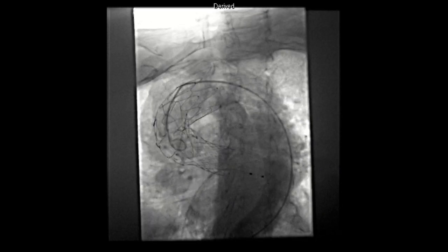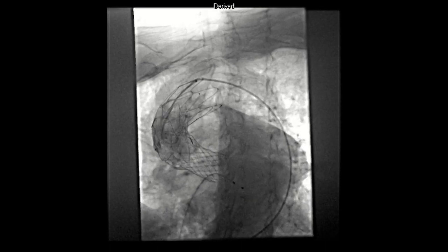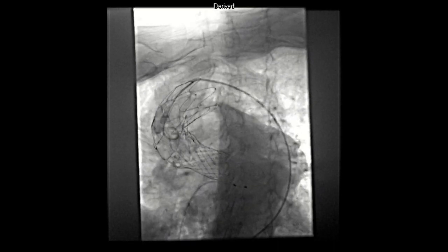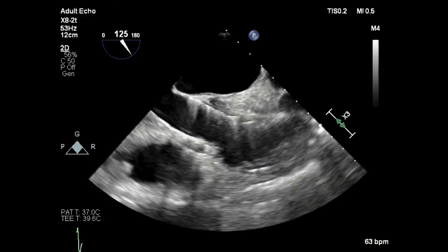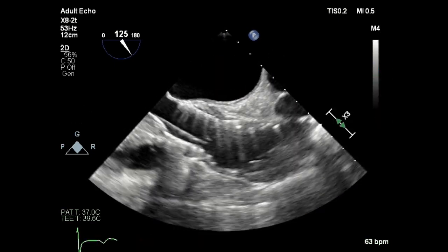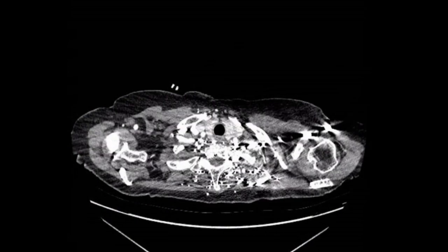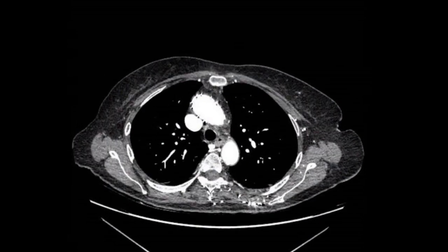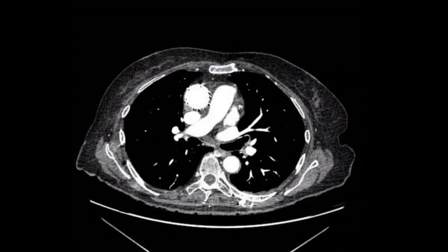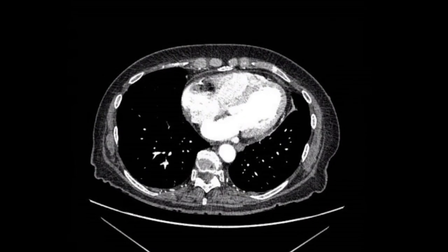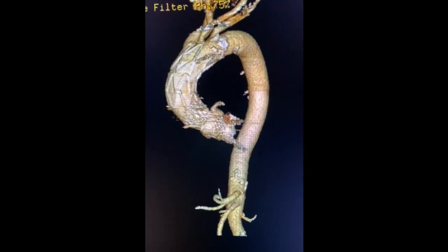The final aortogram and TEE both demonstrated no further evidence of the dissection, and the false lumen appeared to be tacked up by the presence of the stent. The echo showed good flow, no aortic insufficiency, and no flap. It should be noted that the entire operation was done without intubation and general anesthesia. Postoperatively, our patient was neurologically intact and hemodynamically stable. Under one-month follow-up, the patient received a transthoracic echo and CTA chest. The echo showed no aortic insufficiency and a well-seated TAVR valve. The CTA images shown here demonstrated the uncovered stent graft in good position with no evidence of the dissection in the aorta.